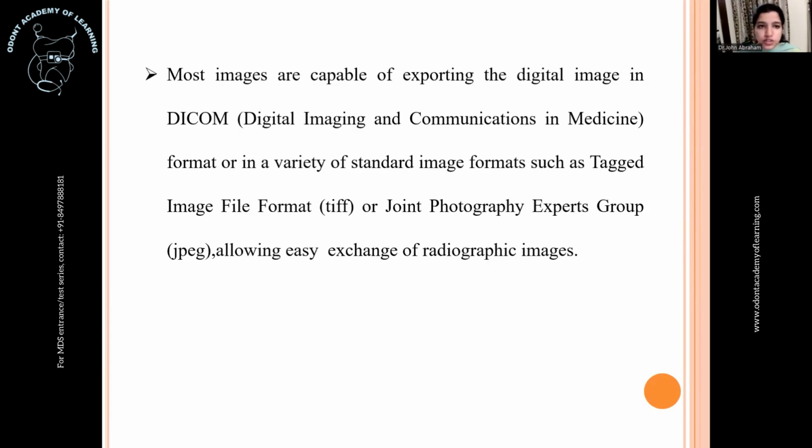And how is it being stored? Most of the images are capable of exporting, and it is being stored as DICOM files, that is digital imaging and communication in medicine format, or in a variety of standard image formats, such as your TIFF, that is tagged image file format, or Joint Photographic Experts Group, that is JPEG, allowing easy exchange of your radiographs.